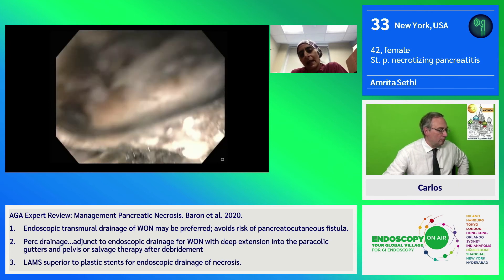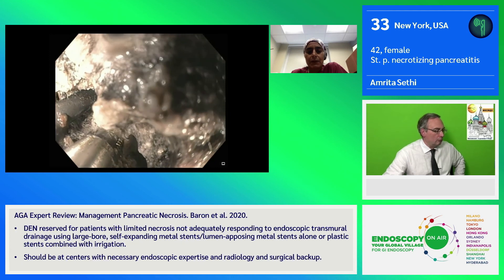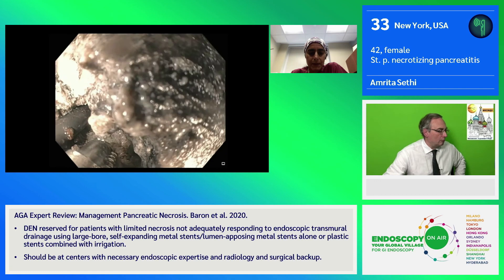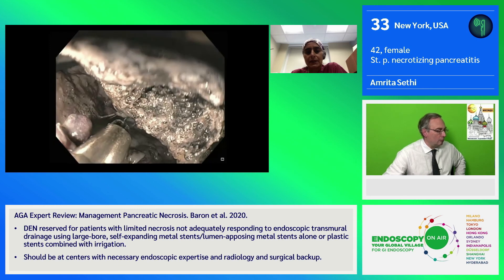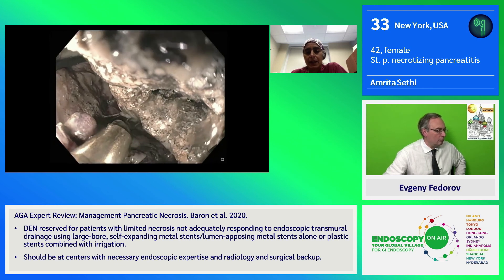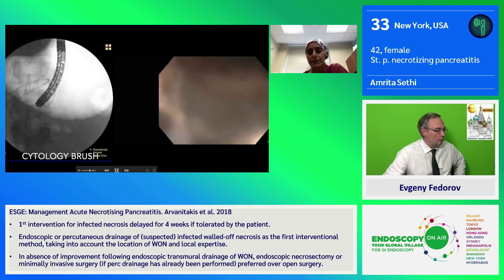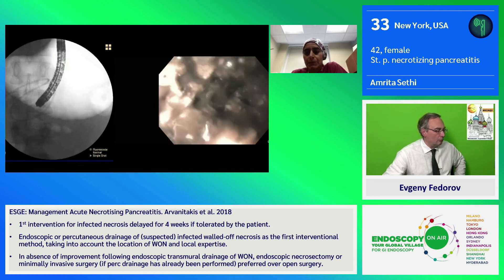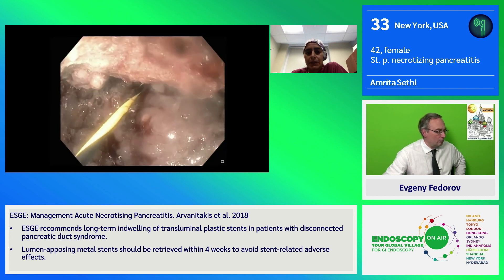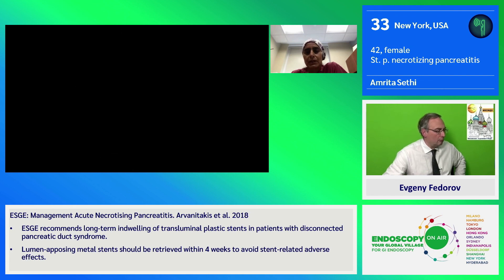This is as tedious as some of the other methods that we have. However, we do not need to go in and out of the cavity itself, and we do not need to perform blind necrosectomy as we do with many of our other tools. After this session, approximately 250 cc's of necrotic material were actually drained, so it can be very effective. At the end of the procedure, we did attempt a novel technique that we have developed here as well — a similar use of a cytology brush. This is the Steris cytology brush that one can rotate, and it does a similar motion with the material. This is the follow-up CT that shows more resolution, and now we will bring the patient back for our last session.